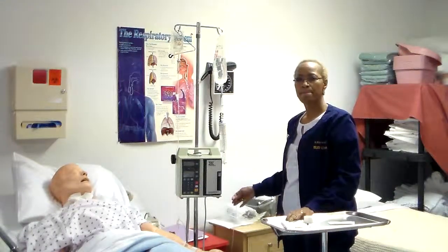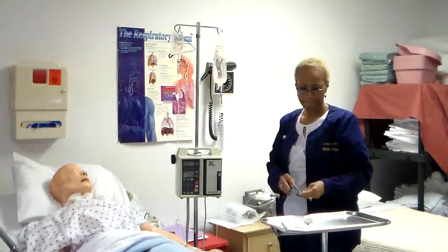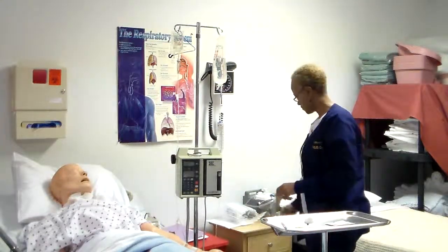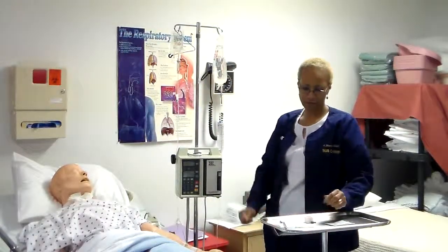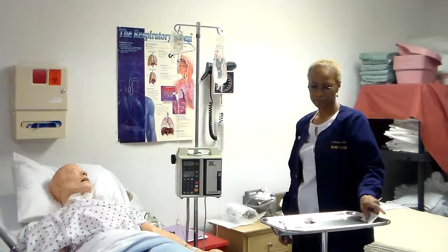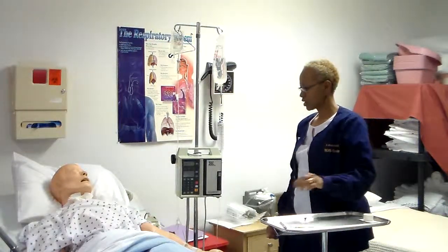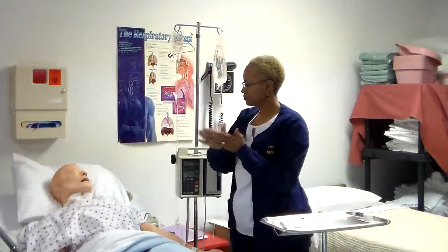Okay? Dispose of uncapped needle or needle enclosed in safety shield and syringe in proper container. Okay. We'll put it in your biohazard container and then get rid of all of your items. Discard supplies in appropriate container and perform hand hygiene. All right, Mr. Johnson, you're all good to go.